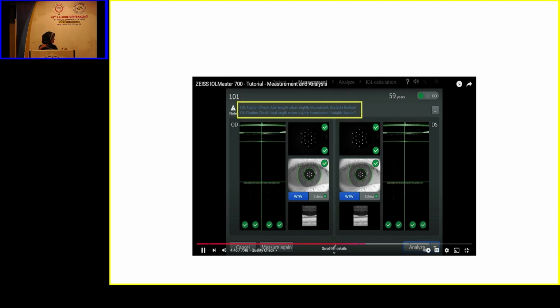So these are all the parameters that the machine is going to look at. It gives us 3 B scans for each eye, the first being the corneal thickness, then it looks at the lens thickness, and then the retina. The top figure in the second column, it's 18 dots that are focused on the cornea, and they give you the anterior keratometry and then the total keratometry.